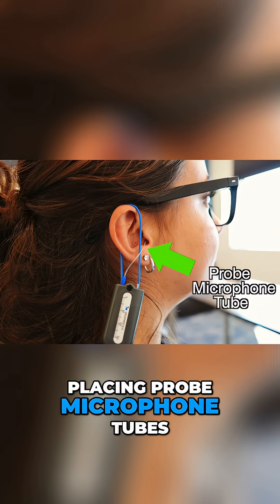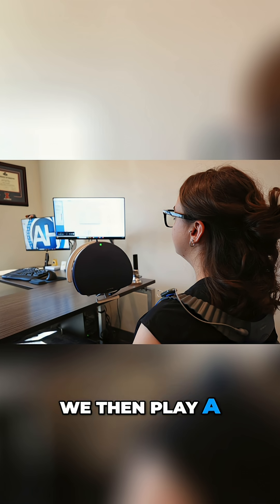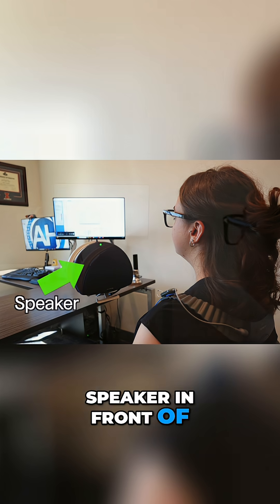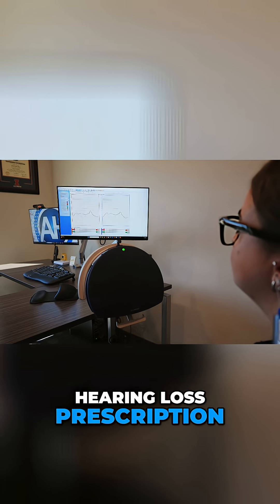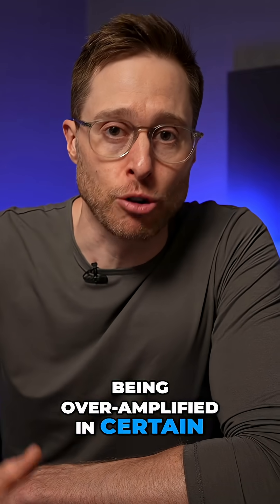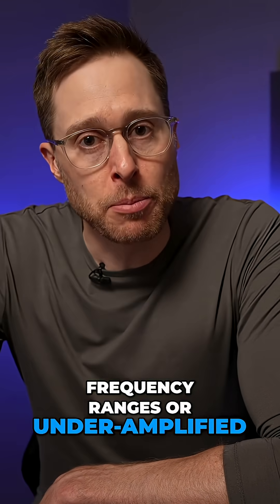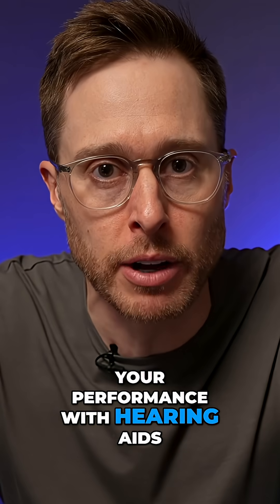We do this by placing probe microphone tubes inside of your ears along with your hearing aids. We then play a calibrated sound from a speaker in front of you and measure how much amplification you're receiving in relation to your hearing loss prescription. Real ear measurement can easily identify if you're being over-amplified in certain frequency ranges or under-amplified in others, which can both destroy your performance with hearing aids.